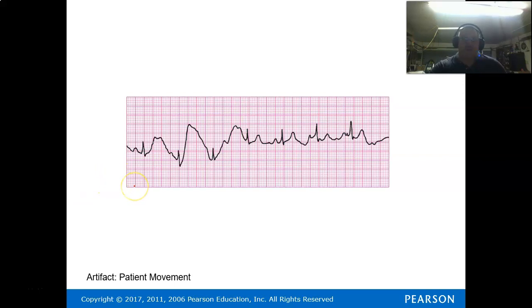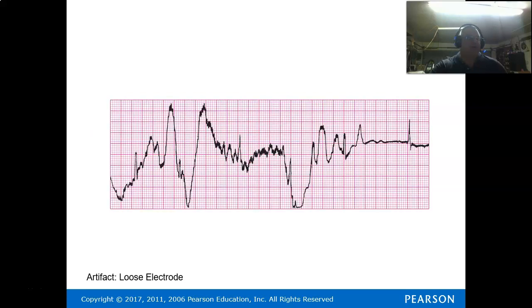And then you got the patient just moves. Yeah, I can't see nothing. Again, you got to tell them to stop moving. All right. Sometimes we get that luxury. Sometimes we don't. But again, this segment here, you focus on the stuff that's normal. And the stuff that's normal is this area, well, sort of, kind of. This is the guy still moving. I would probably try to get a better tracing.